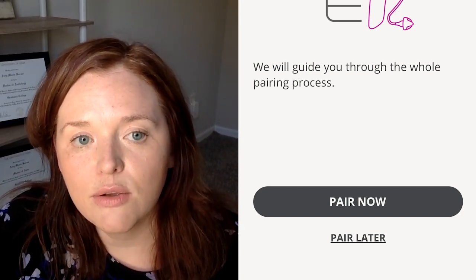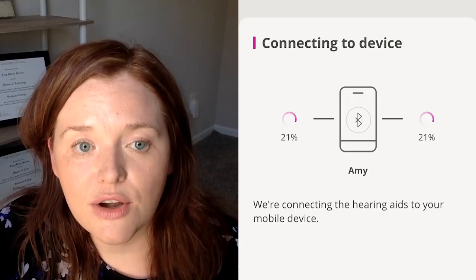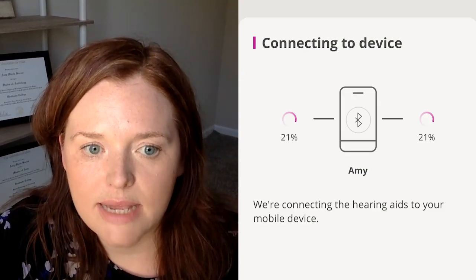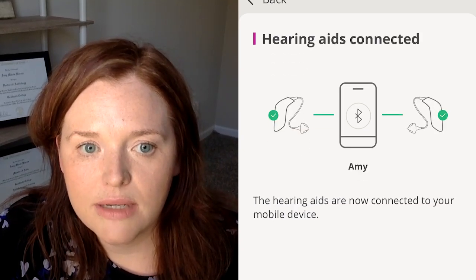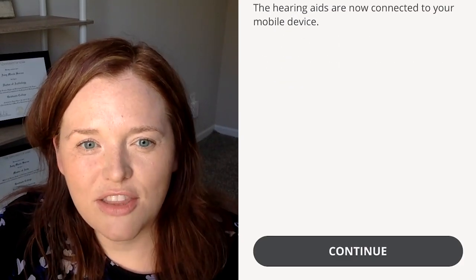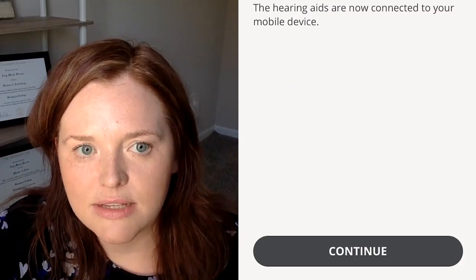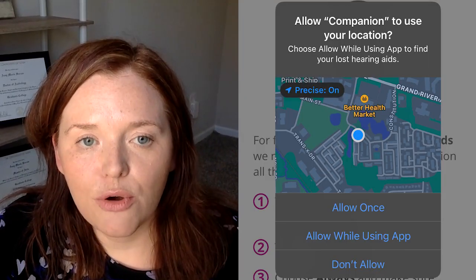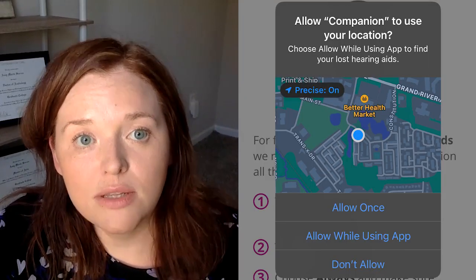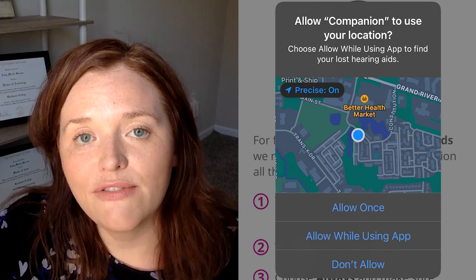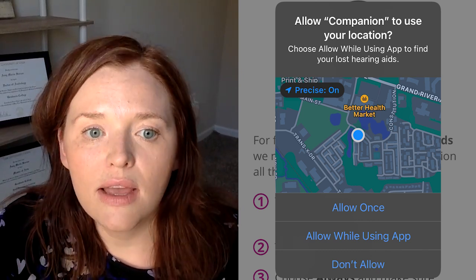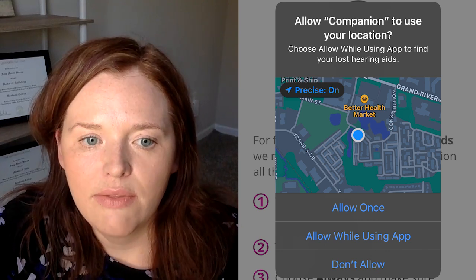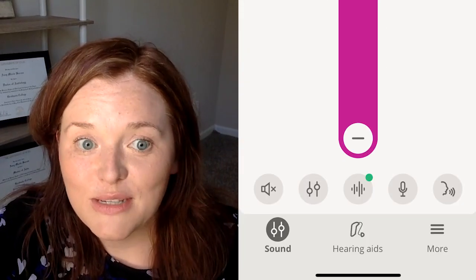You'll hit continue, and then you should see the green check marks that that has gone smoothly — hit continue. Then it will prompt you for location services. So if you want to use the find my hearing aid feature, select 'allow while using the app.' Then you are ready to start using the app.